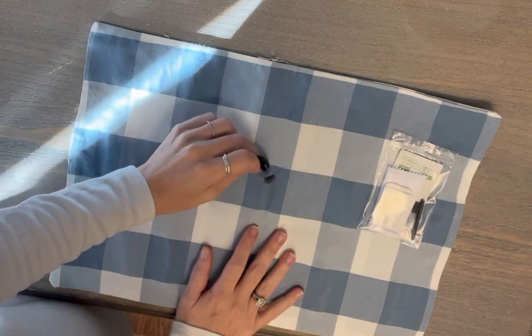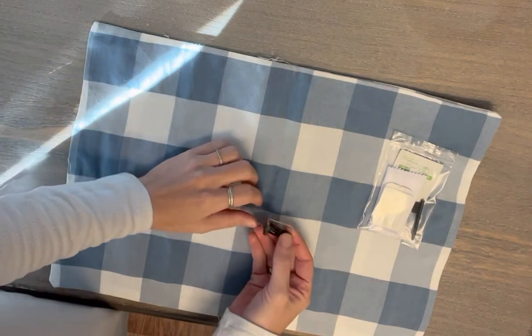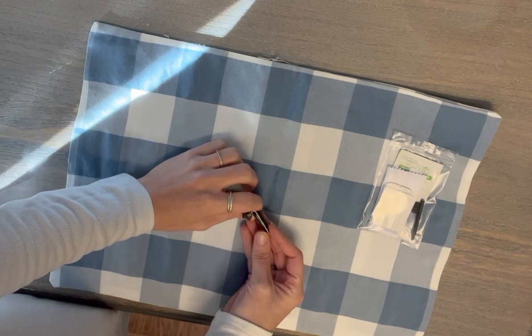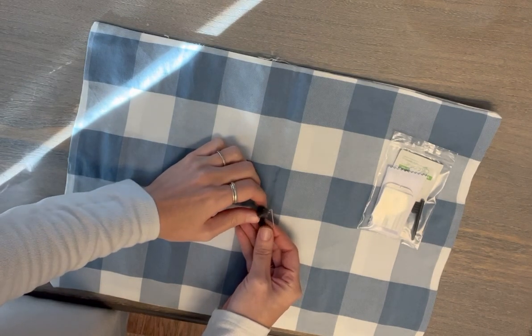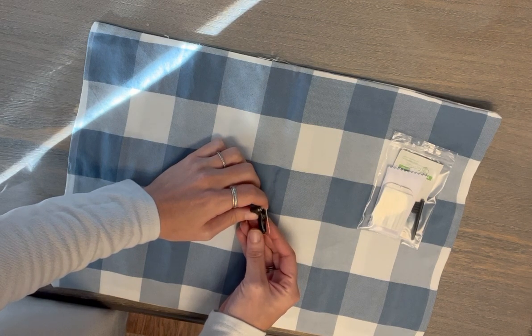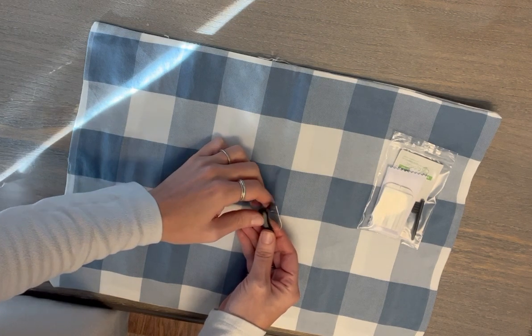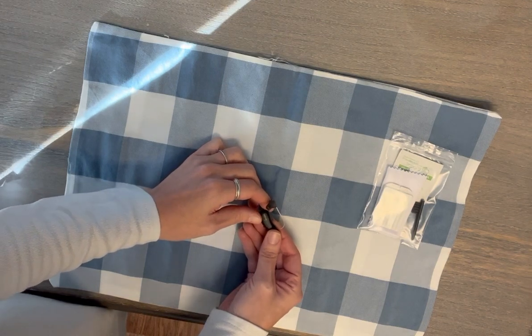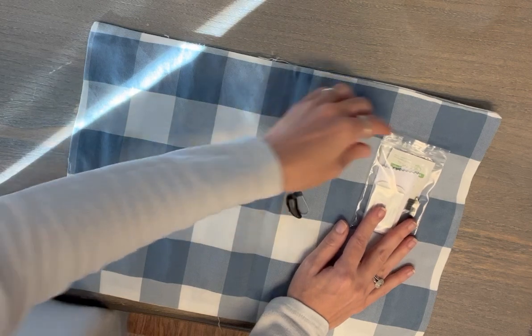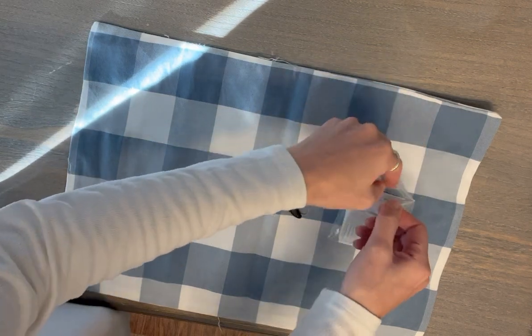Dr. Merrill here in the Coates lab, going to teach you how to clean a Signia AX Pure Charge and Go. This is the newest product line of the Signia devices, of the RIC device, which is a receiver in the canal. So when you get your hearing aid, you will also have a cleaning kit with you, and I will go over what's in the cleaning kit.